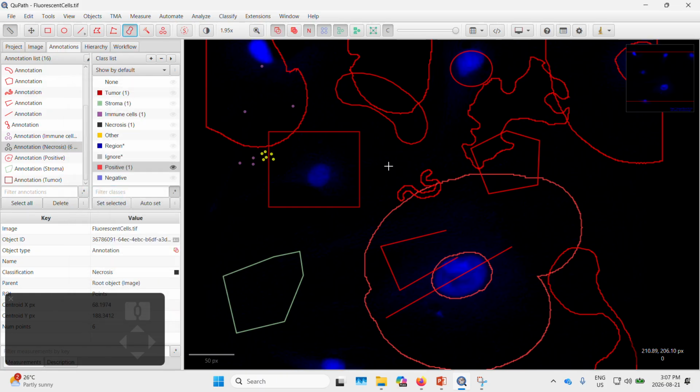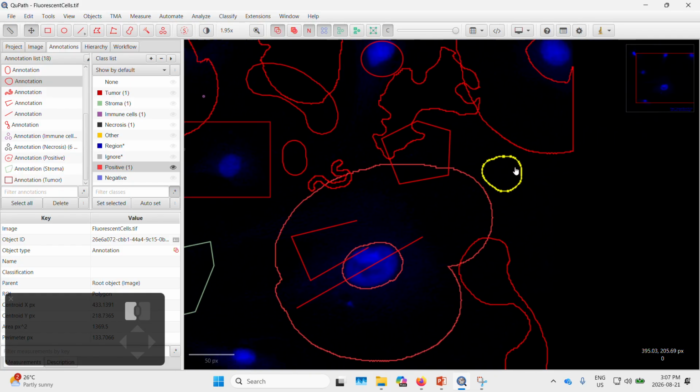If, say, I use the brush annotation and then click off and press the middle mouse button, I can go back to the brush. I can also toggle off the brush annotation by selecting the mouse button to go back to panning.